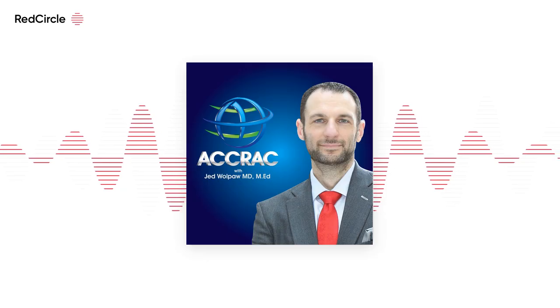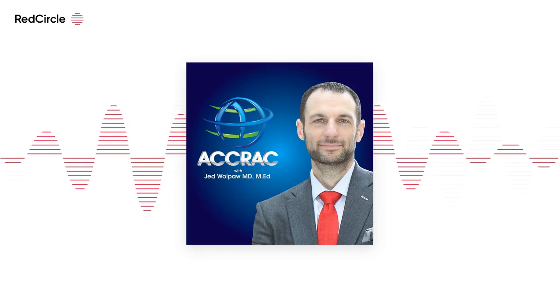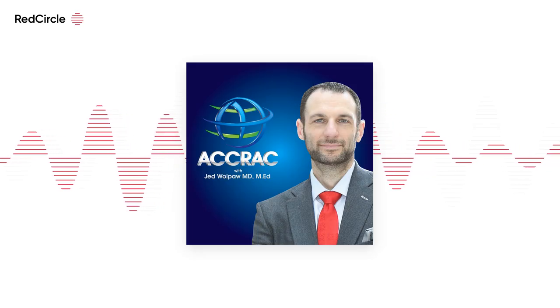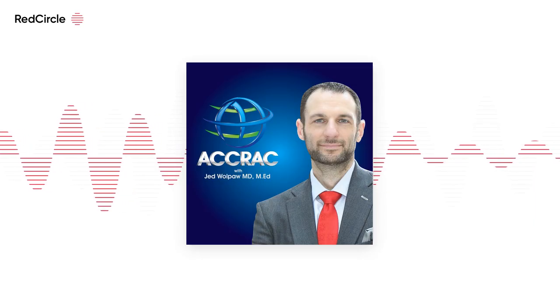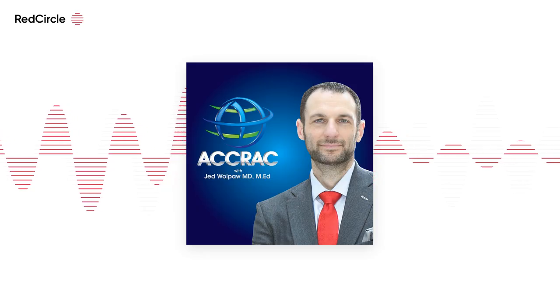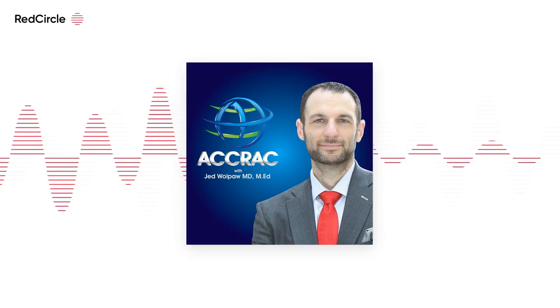And as we're doing that, because we had esophageal pressure manometry, we could see the transpulmonary pressure changing, basically going up, meaning your PEEP is now too high, as they were draining fluid from this lady's abdomen. So it allowed us real-time optimization of PEEP with transpulmonary pressure. With experiences like that, I got really, really excited.